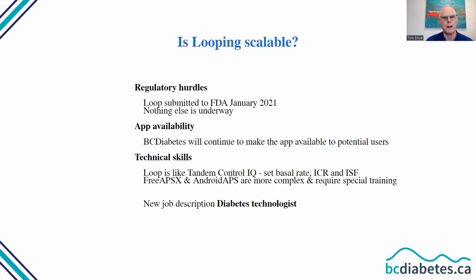The first one is that of regulatory approval, or rather the lack of it. The Loop app was submitted to the FDA early last year, and everybody's waiting patiently for a verdict. No other open source APSs have been submitted to any regulatory agency worldwide.